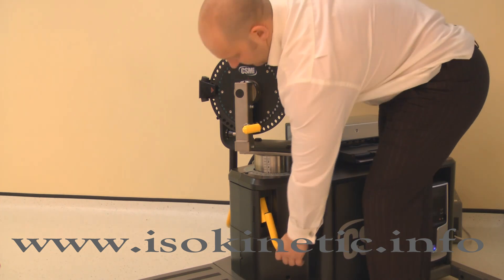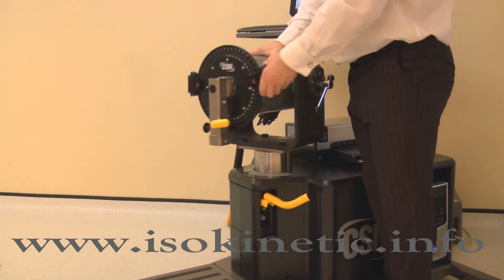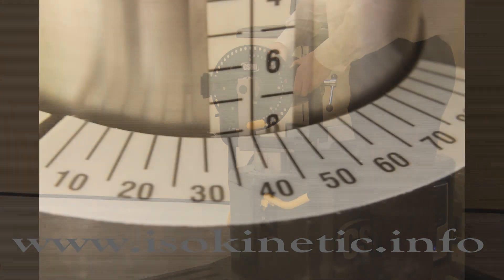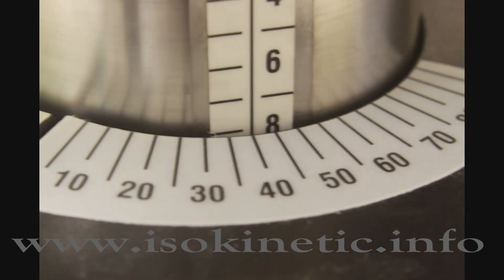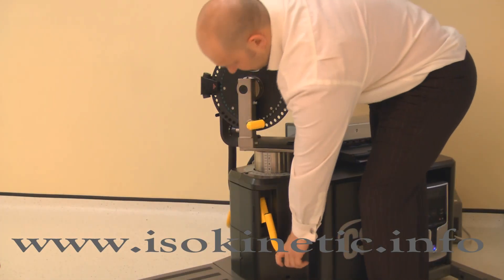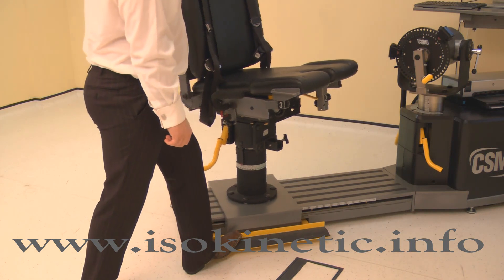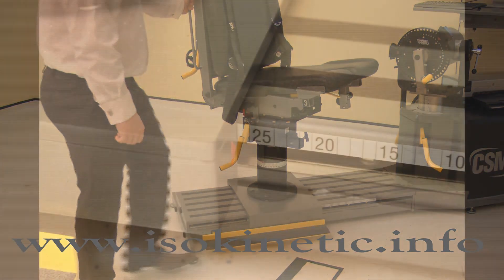The dynamometer height and rotation are adjusted together. Lift a locking handle to release. For the left knee, rotate the dynamometer to 40 degrees on the black scale, whilst also adjusting the height to 8. Ensure both locking handles are pushed down to secure. Finally, position the monorail by pressing the kickboard and sliding the chair to position 27.